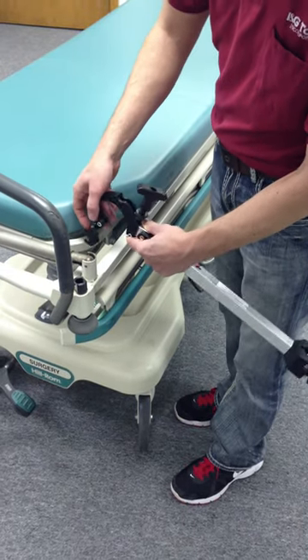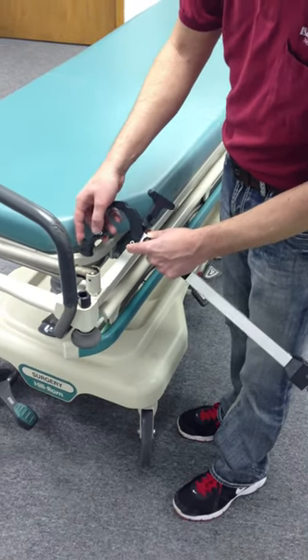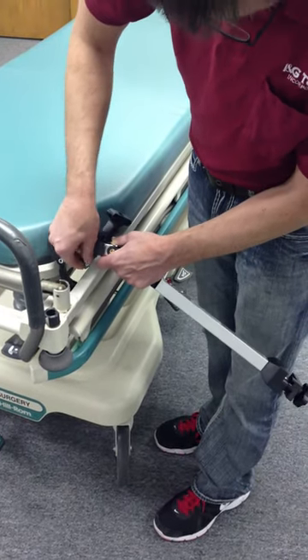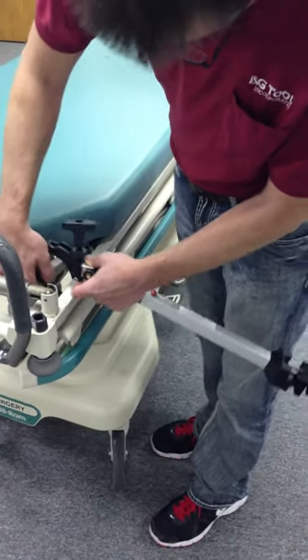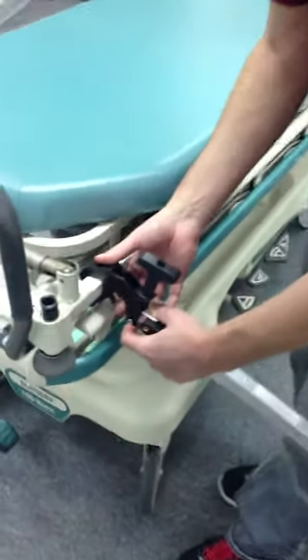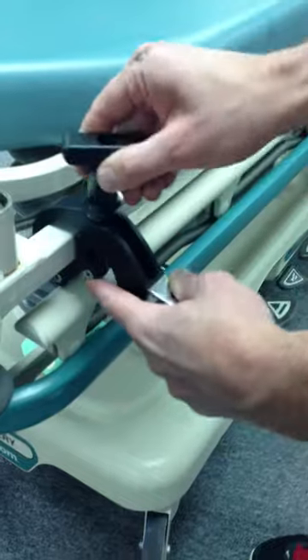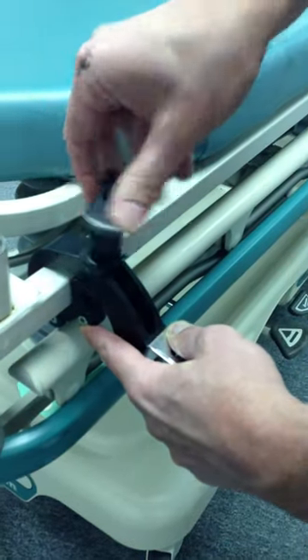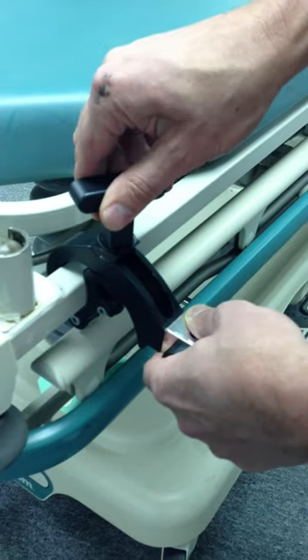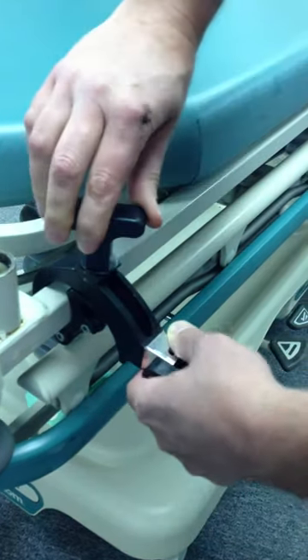All right, so here we're going to show you the CH-6000 universal clamp. We're going to clamp it onto square tubing here. You have to find your spot wherever it's going to be. Right now we're going to put it onto the square instead of round. So you got to tighten up the clamp on there, however you want it. That's secure.